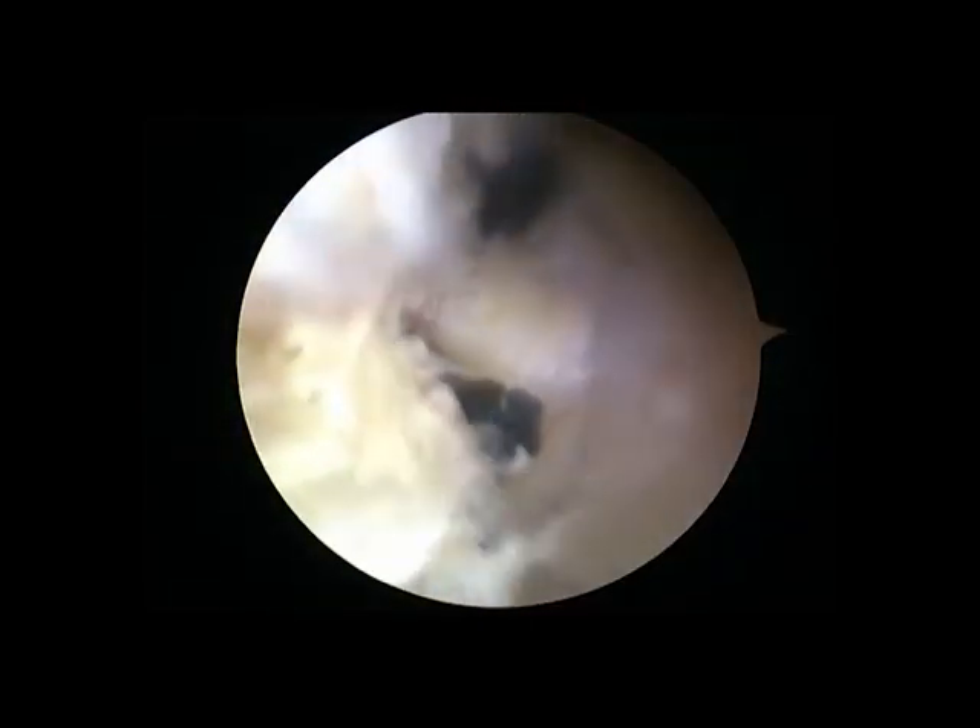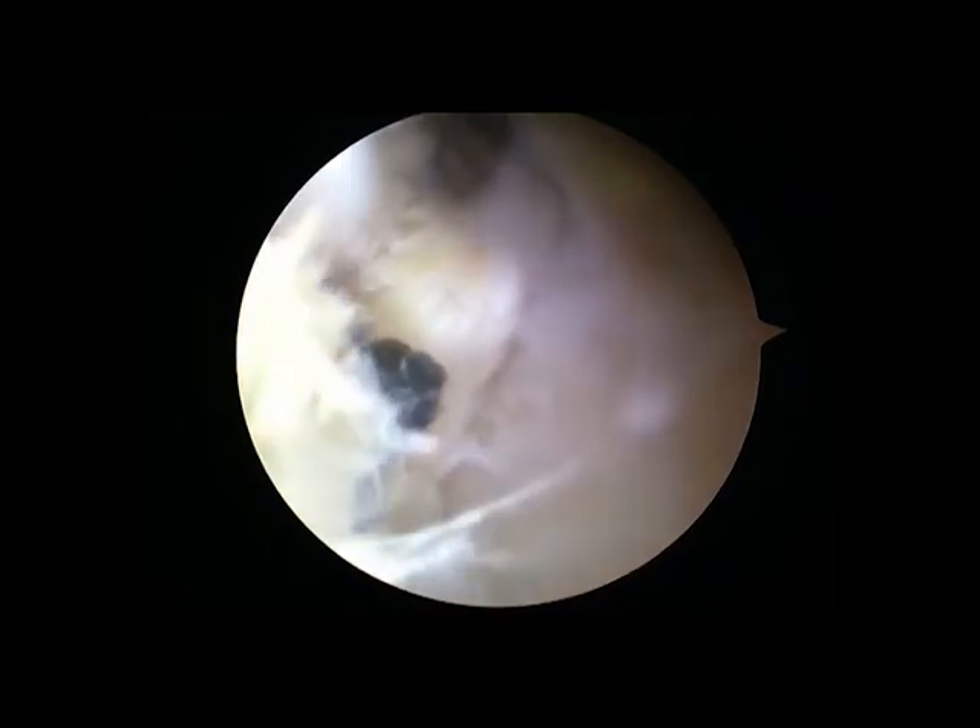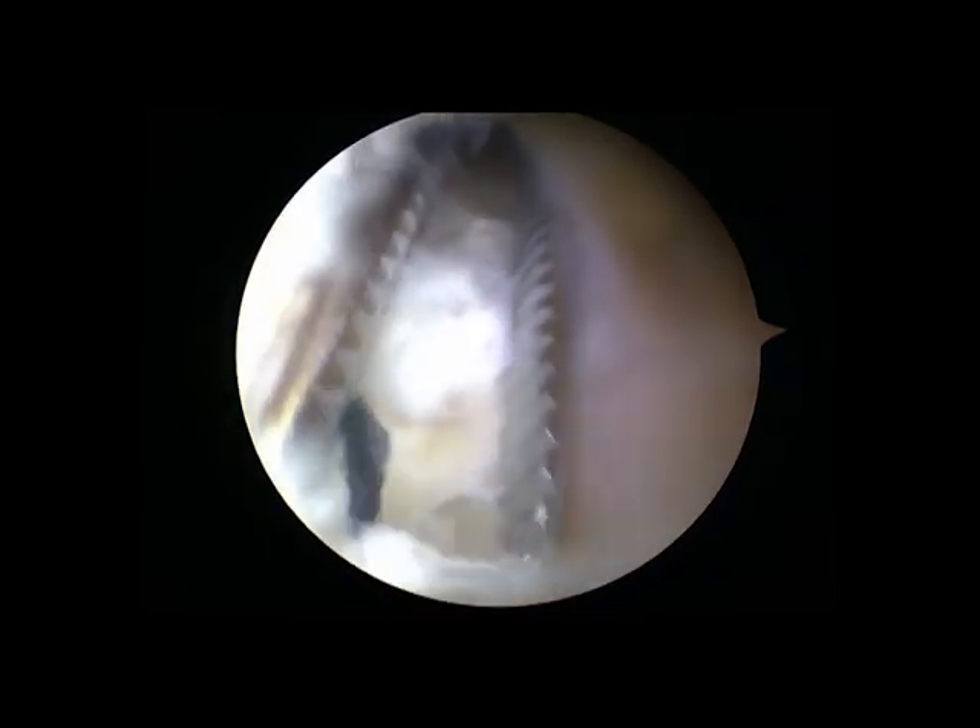As shown in the video, a non-absorbable suture can be seen, and it is then removed.